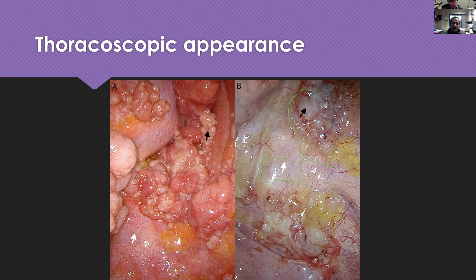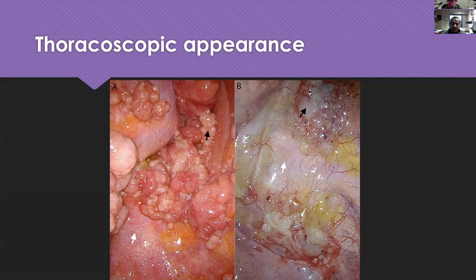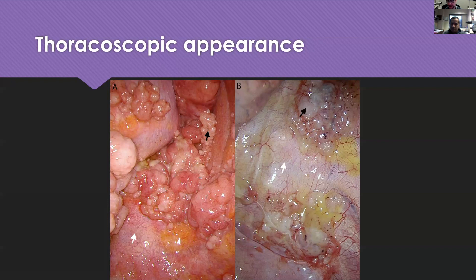The differential is mesothelioma and carcinoma. These polypoid, grape-like areas — I wonder if that's just how they're growing because they're growing into this potential space, and there's nothing on the other side — so the biology is they're going to kind of look like this, growing into air essentially. It's important for pathologists: I try to look at the surgeon's note to see if they saw a diffuse process growing along the pleura, because calling something mesothelioma is very dangerous if they didn't see a diffuse mass-like or rind-like process. Imaging and patient history are also important aspects.